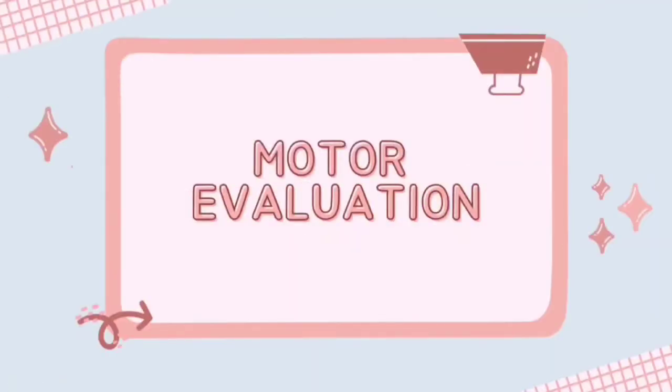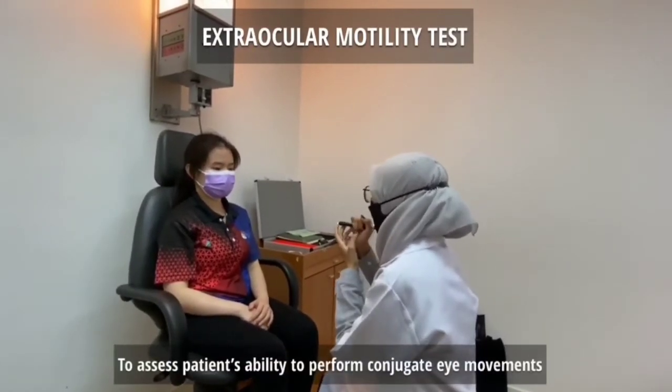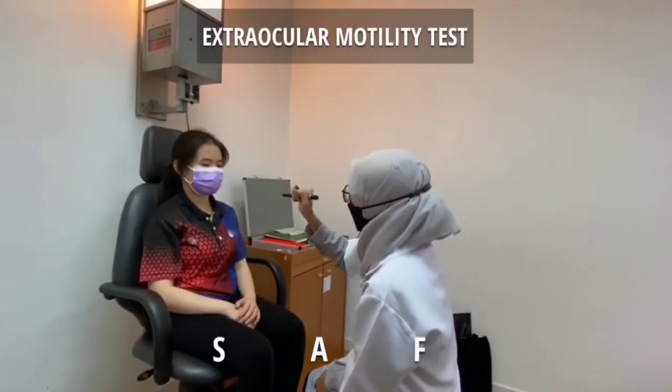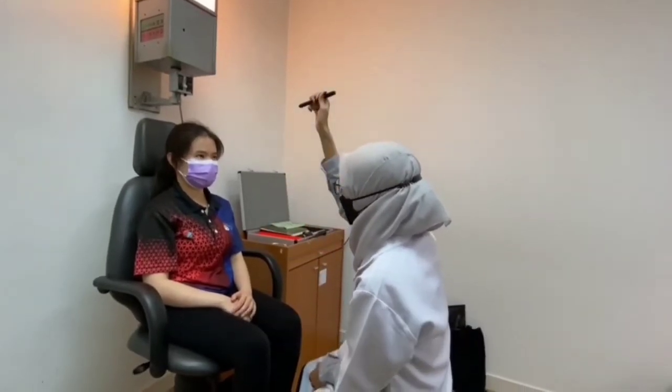Then, there are a few tests to evaluate the motor function. First is extraocular motility test. This test is to assess the patient's ability to perform conjugate eye movements, and the expected finding is SAFE, which stands for smooth, accurate, full, and extensive.